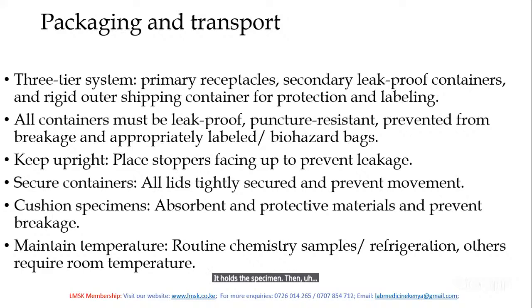Then you insert it into a second larger container, which should be leak-proof. Then finally, into the third container, which will be the transporting container. All these 3 containers have to be labeled, and they should be leak-proof, puncture-resistant, prevented from leakage, breakage.